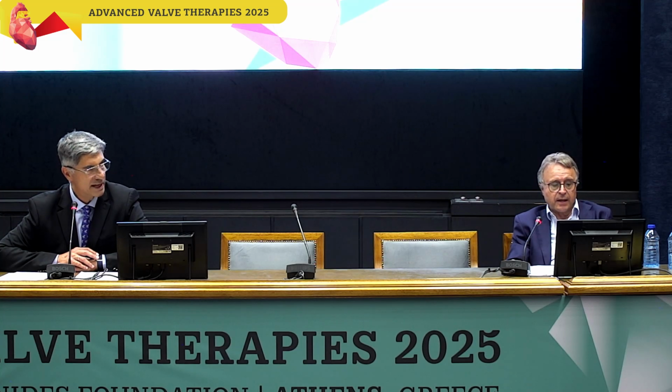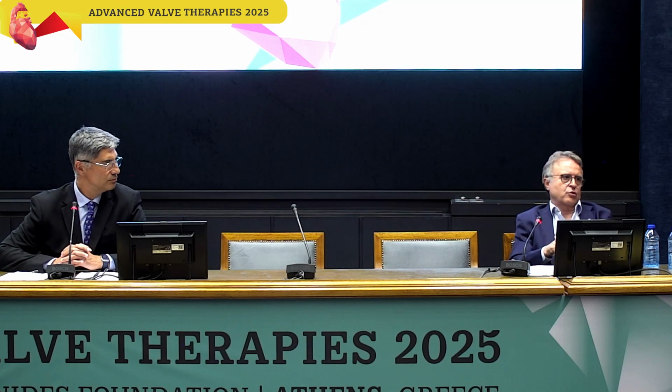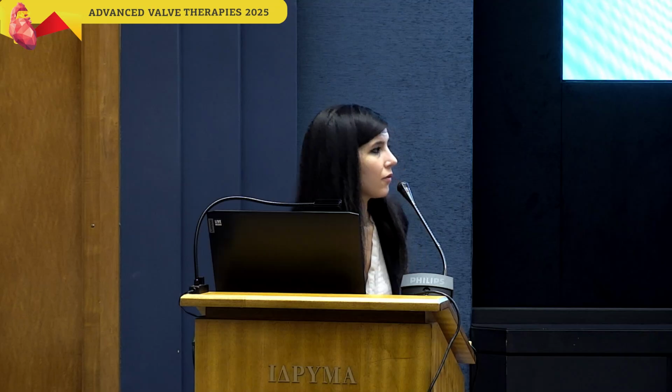So, Vasily, you were asking about the technicalities. I think that this may happen because the valve, because of the calcification, is not stable and sometimes moves. I don't know if you have signs of that. And another question from a technical view: do you need to have a transesophageal echo? You had it also, yes. Because it's very, very important. We did the measurements initially at the procedure, Dr. Mezilis, for the correct size, and we are giving constant guidance during the procedure.